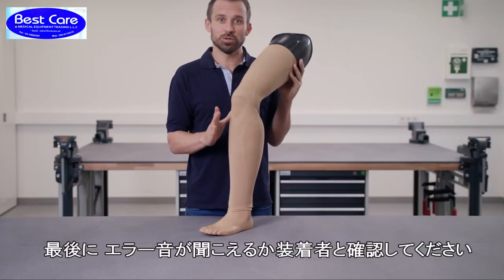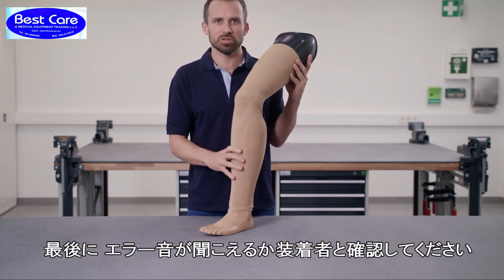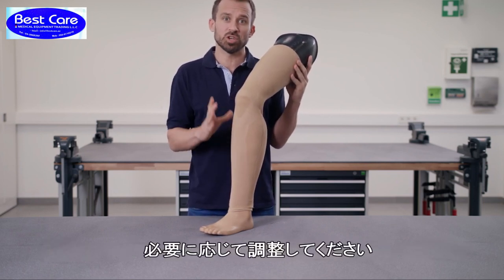Finally, you should, together with the user, check that the warning signals of the mechatronic joints are audible, and adjust them if necessary.